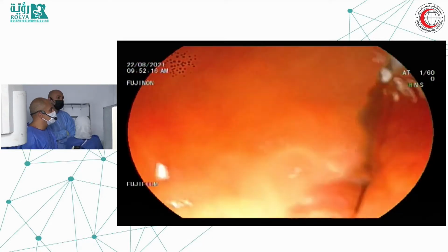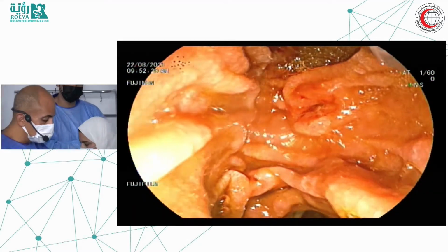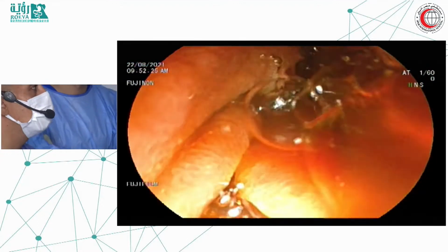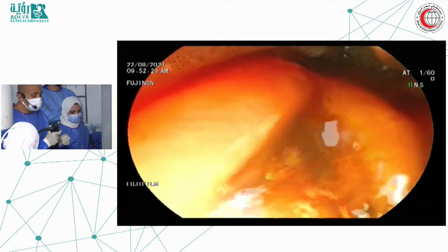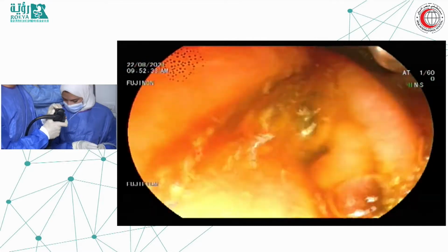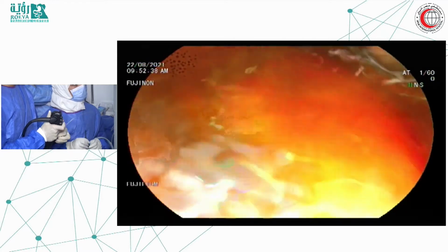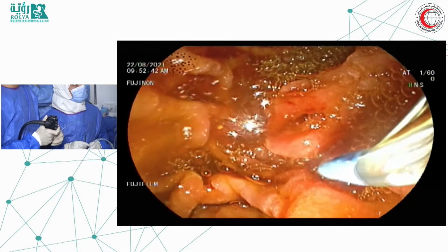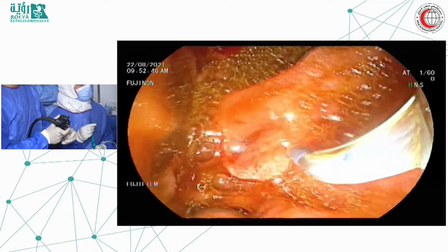We always have this in training courses when Hany and I work together, and I learned endoscopy in a place where if you cannot cannulate by cannula, you should not cannulate by a sphincterotome. This is not my daily practice now. Yes, it's easier to start with a 3-lumen sphincterotome. However, one of the good things about using the cannula is that it helps you have more and more control of your scope.